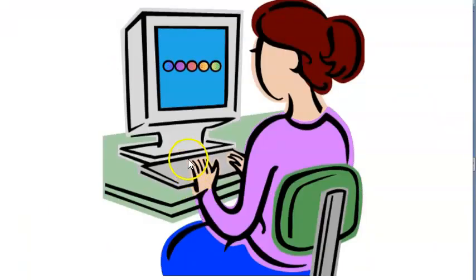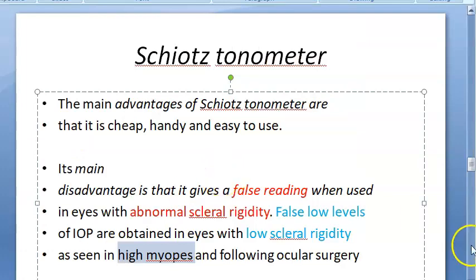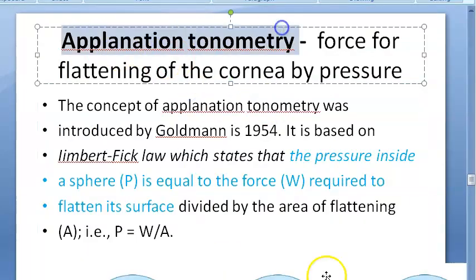Did it make any sense to you guys? But it can give you false readings in some cases. That's all I can understand. Okay, now let us go to Applanation Tonometer.